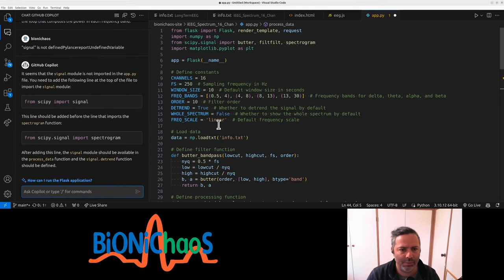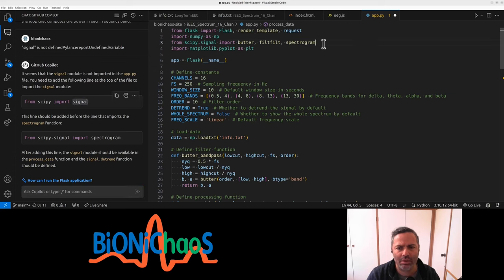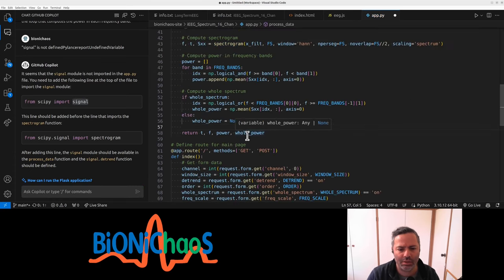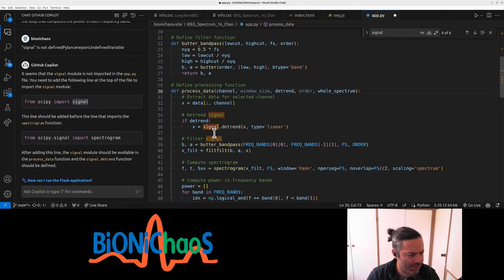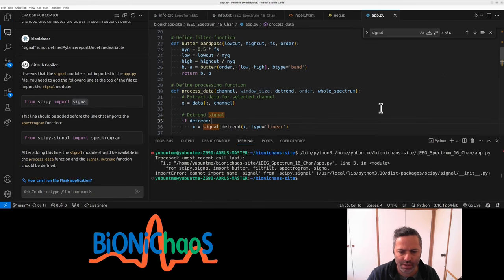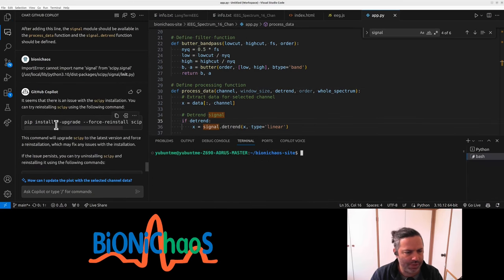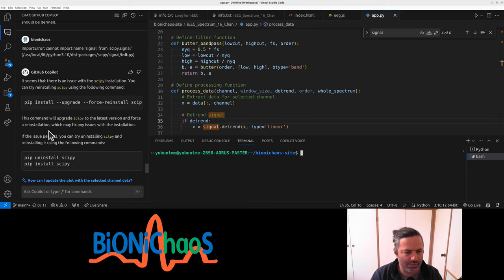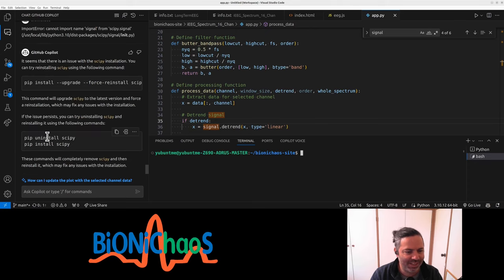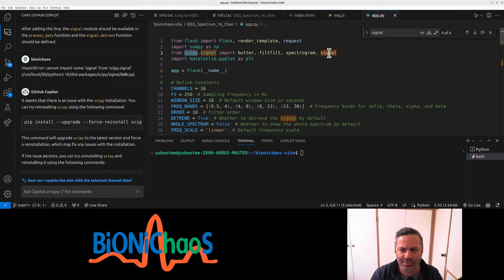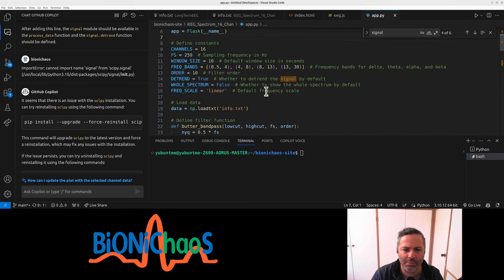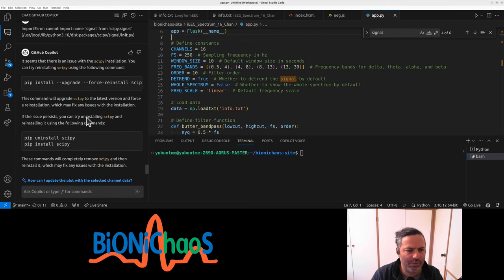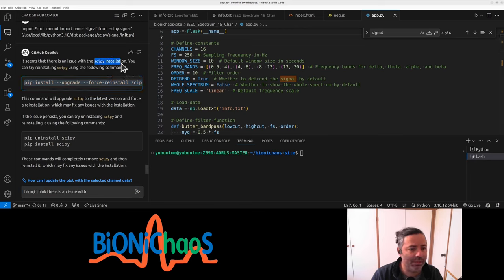An easier way of doing it. I already have spectrogram, I also need the signal. Did it actually work? Not sure about this one, especially forcing reinstall. Why do I need to force reinstall? If all the rest is working, how do I do this importing signal? I don't think there's an issue with scipy installation.